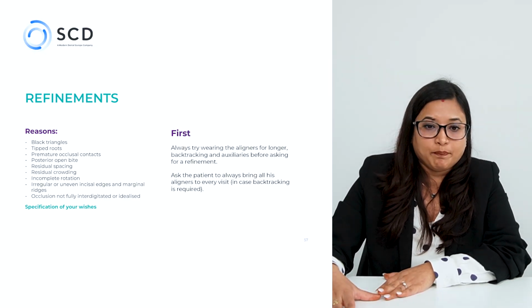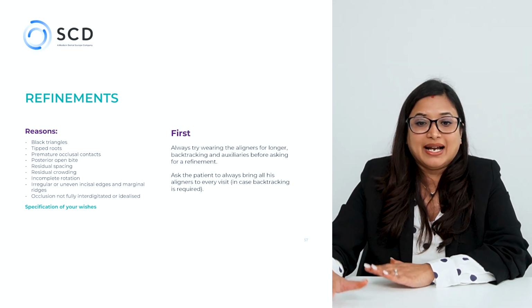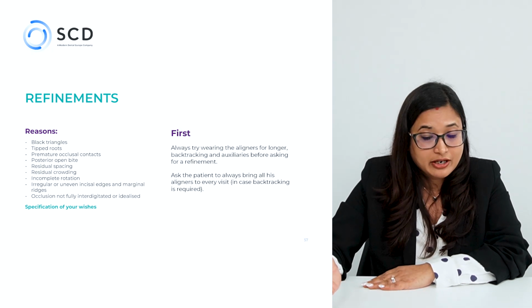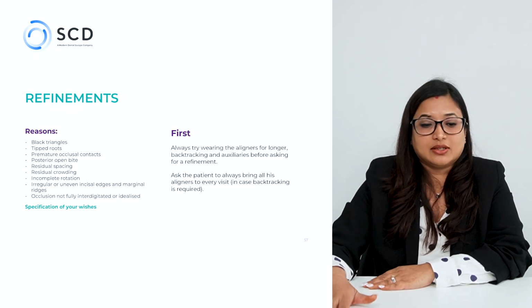related to clear aligners. So always try wearing the aligners for longer, backtracking in auxiliaries before asking for refinement, and ask the patient to always bring all their aligners to every visit again.